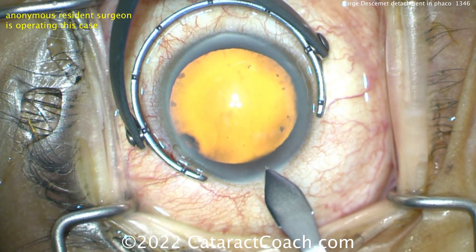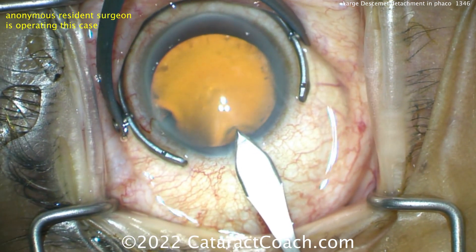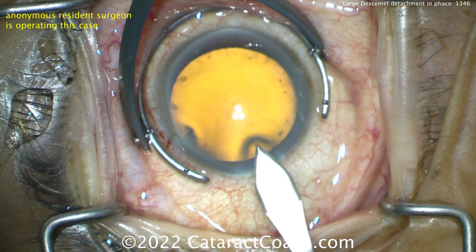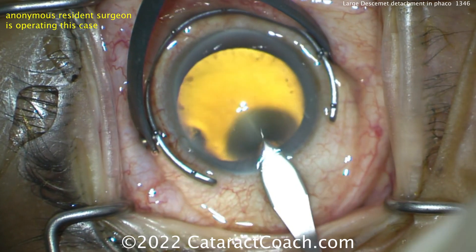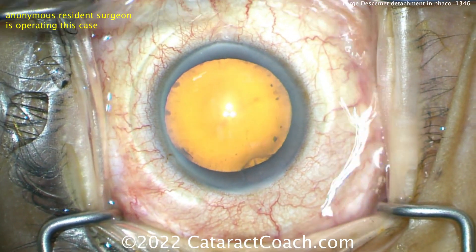I was not present for this case. This is a resident operating with some other professor attending the case. Here's the incision at the beginning of the case — a little bit too much in the cornea, but not terrible, not a bad incision. The incision is tolerable. Reasonable. We'll take that.